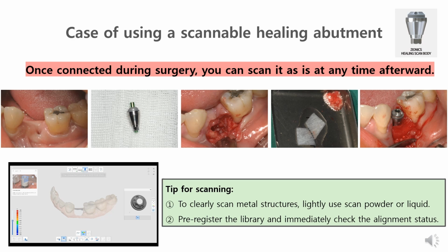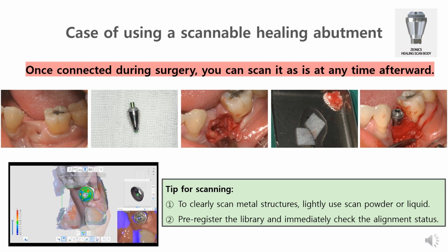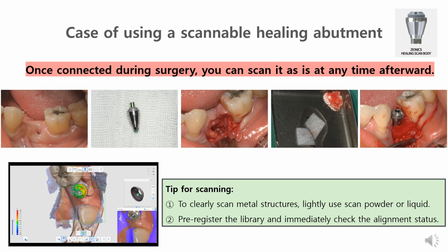Once this is done during surgery, scanning is all we need to do on the day of suture removal. The alignment was completed using the AI matching function, a strong feature of the Medit program, and the entire scan was finished in just 5 minutes. Depending on the condition of the implant, we can decide when to deliver the prosthesis, which makes it convenient for both the clinician and the patient. This is truly a revolutionary workflow improvement achieved by introducing digital techniques into the clinic.